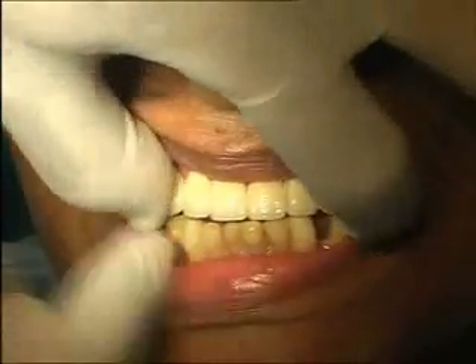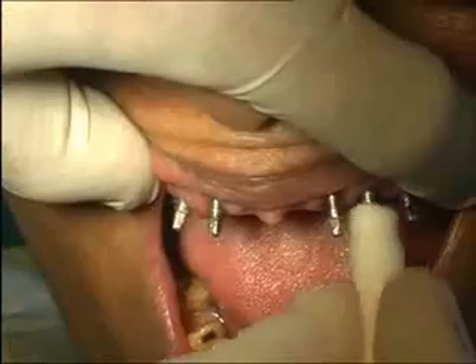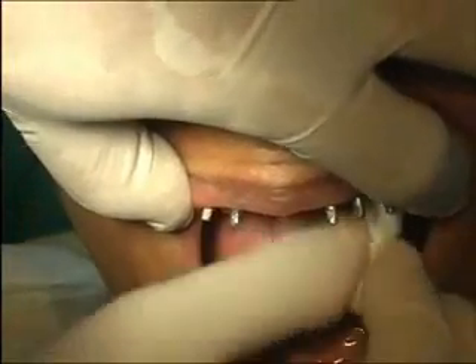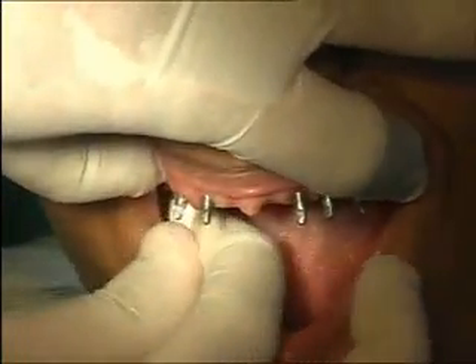I will do some recalibration because the upper teeth are missing — the molars have extruded a little bit, with a sharp edge. His name is Dr. Stephen Ige and you are most welcome to go on the site and see.